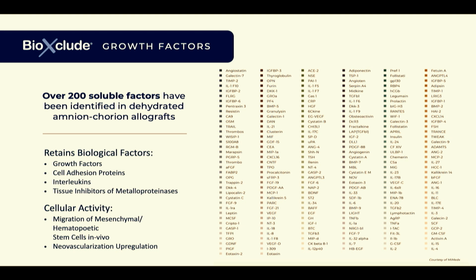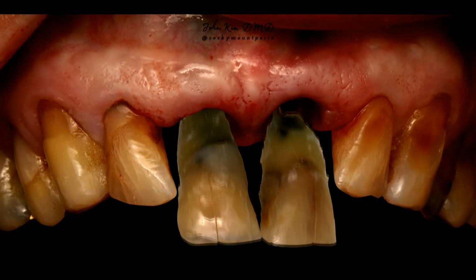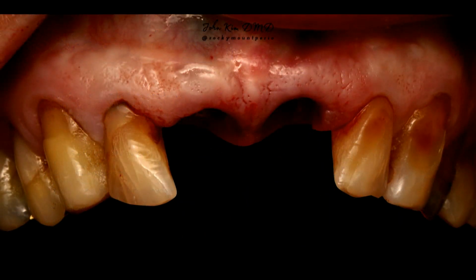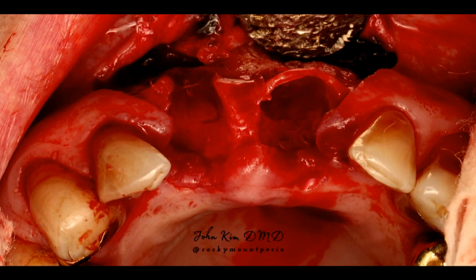And that's, again, I emphasize over and over again, what is unique about this barrier membrane. It's the only one out there that has growth factors, a sustained release of growth factors over an 8 to 12 week period as the membrane is resorbing. And so here it is: 2 teeth easily taken out in a flapless manner. I knew from the CT scan that I was going to raise a flap regardless, but I wanted to keep this atraumatic as possible because I was worried about how much he would ooze and bleed.